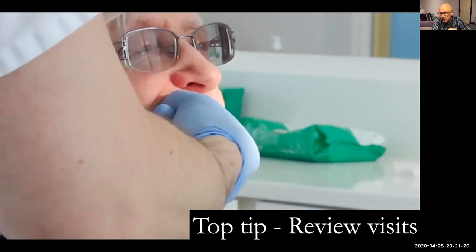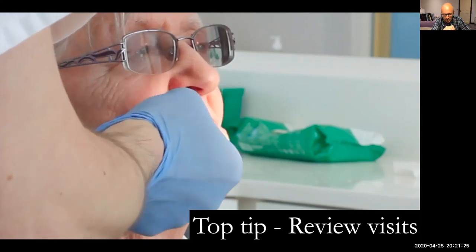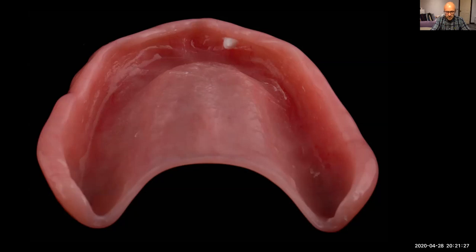firmly, back into place. It's a bit sore when you do this. Take out the denture, and then what shows up is the ulcered area is picked up in the fitting surface of the impression like that. And then I use my tungsten carbide to adjust it, to make it comfortable. It always feels a little bit uncomfortable, even after adjusting it, but it should feel better.